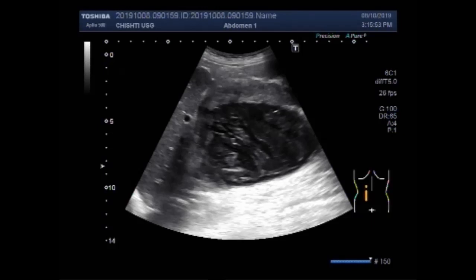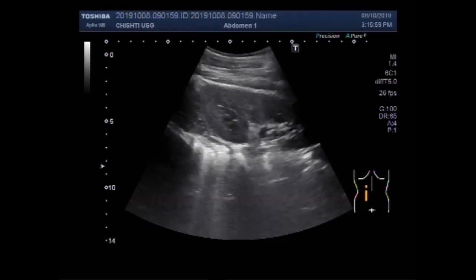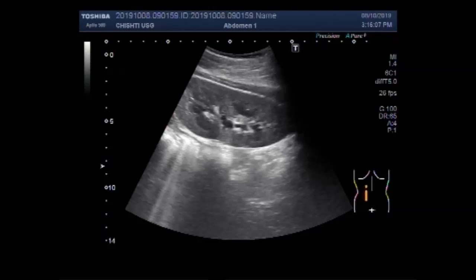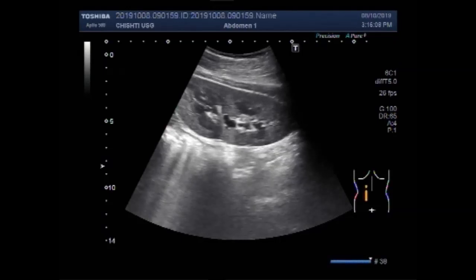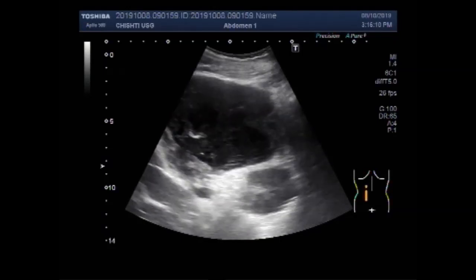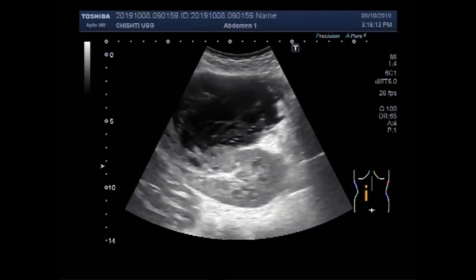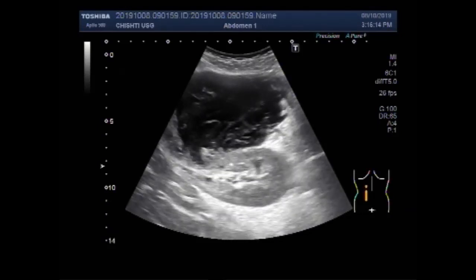Now you can see this mass. This is the left kidney and it looks ecographically normal. No sign of obstruction or stone is seen. Now you are going to see the right kidney.